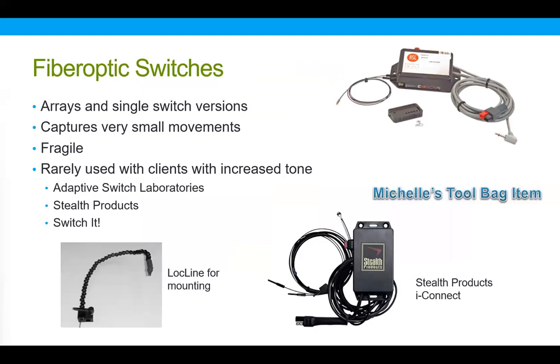So let's get into fiber optic switches. Fiber optic switches, like proximities, are an electronic switch that do not require any force. They do require a power source. And I should have mentioned on some of those other proximity switches, we may also see that the power source comes from a power wheelchair if someone's using those as a driving method. Otherwise, there's a battery, an external battery that comes with the switch that is usually rechargeable. So if you're using any of these on a power chair, you're golden. Power is just not an issue.